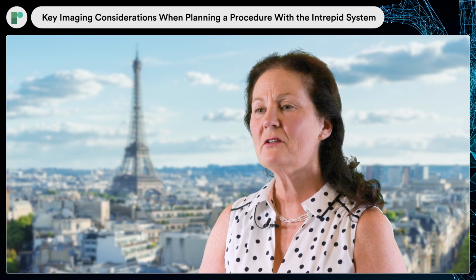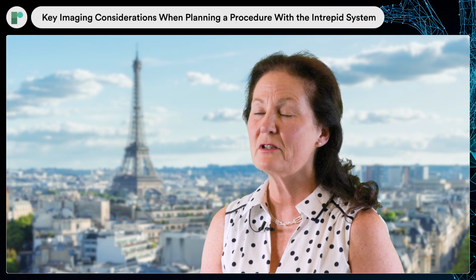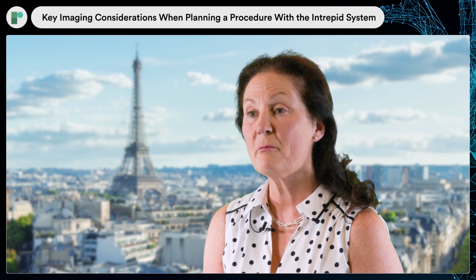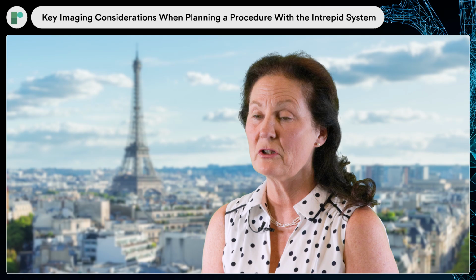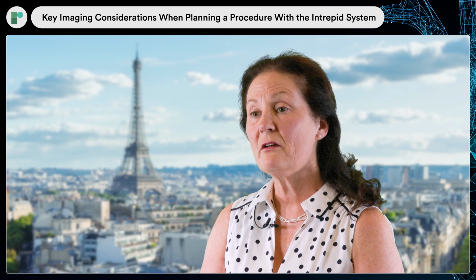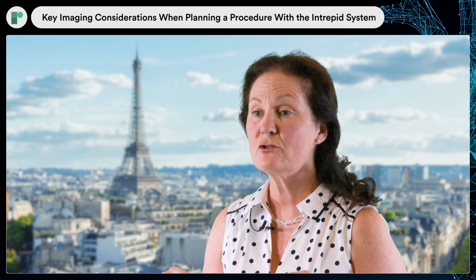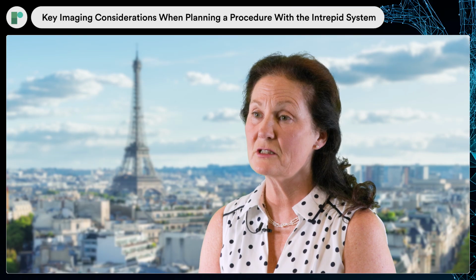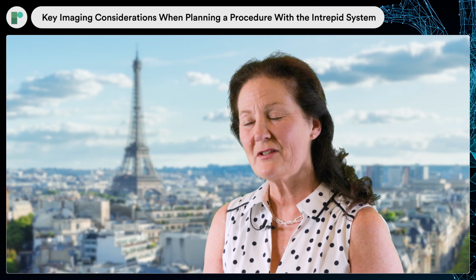And equally, because it uses radial force against the mitral valve annulus, we don't have to worry too much about the subvalvular apparatus docking system type procedures that are available in other forms of TMVR. But we do need to think about left atrial size, the anatomy of the interatrial septum, and the subvalvular apparatus insofar as the distance of the papillary muscles. That's just outside of the mitral valve itself.